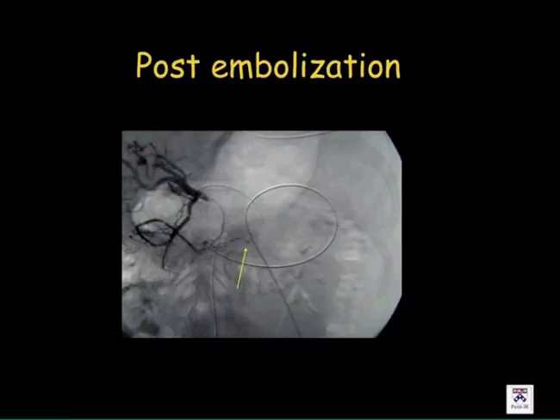So we embolize it. And here we actually managed to embolize from both ends, because as you can imagine, the gastroepiploic artery is a kind of arch supplied from both ends. So in order to close this bleeding, you have to embolize both doors. I don't know how we managed from the hole in the stomach to get into the other side of the artery, but we managed, we embolized both sides, and the patient was cured. Do you think my partner changed his practice? No. It was 14 years ago, and he still continues to put the gastrostomy tube through the greater curvature, with no issues at all. But, just an example.